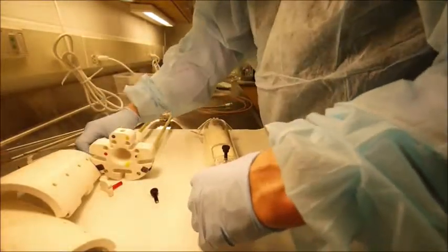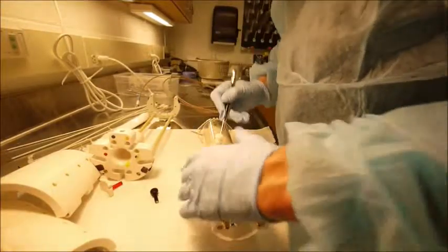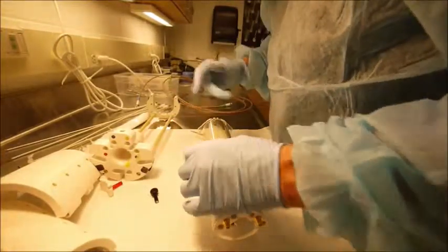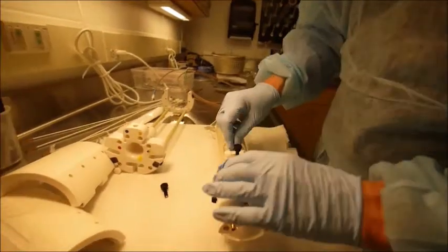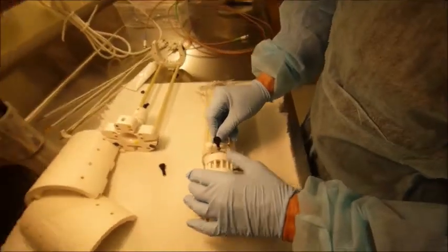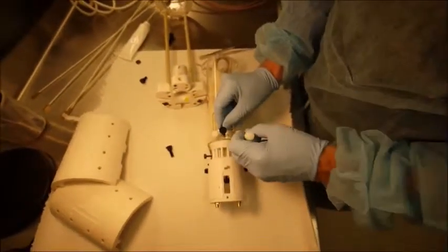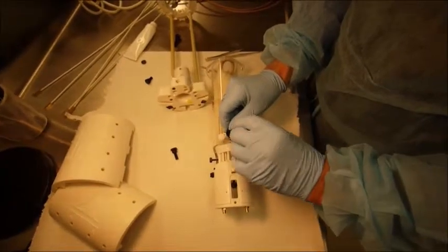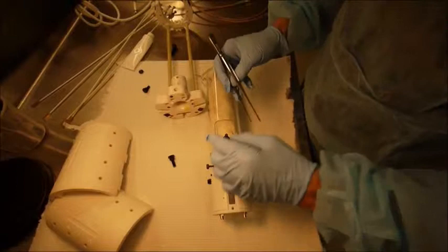Drop in the right shoulder bar. Position the shoulder plate side groove into the right shoulder bar. Drop in the left shoulder bar, securing the shoulder plate. You can adjust the height of the shoulder plate with the center screw.